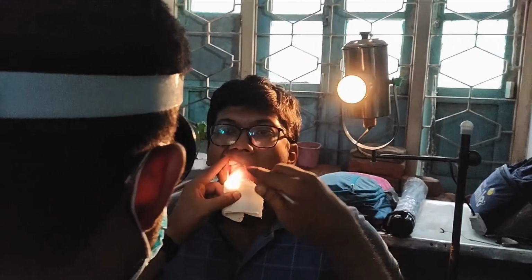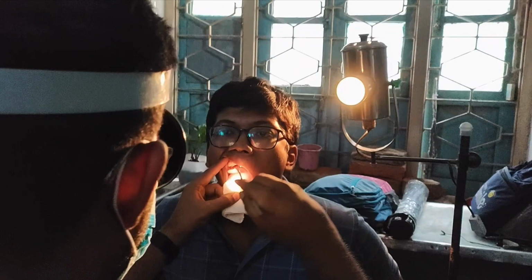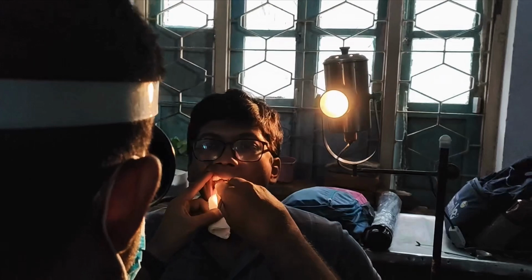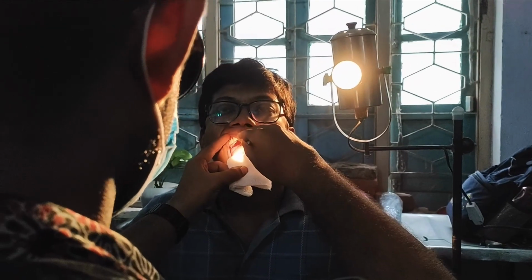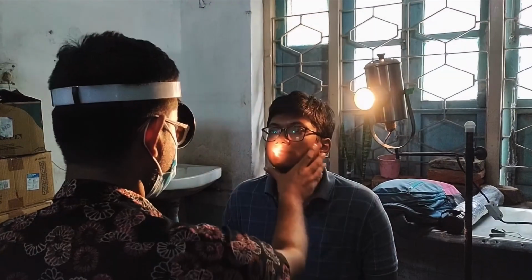Before introduction of the indirect laryngoscopy mirror, it is important to increase the temperature of the mirror to the core body temperature. It should ideally be put in boiled water and then dried so that there is no fogging of the mirror. Now I will introduce the indirect laryngoscopy mirror and hinge it on the uvula and soft palate, taking care not to touch the posterior one-third of the tongue or the posterior pharyngeal wall. That is the position of indirect laryngoscopy.